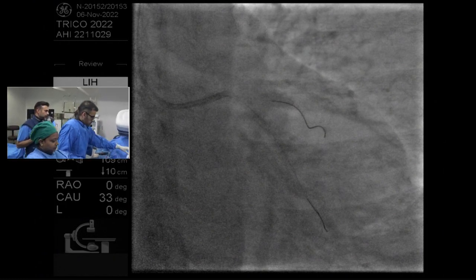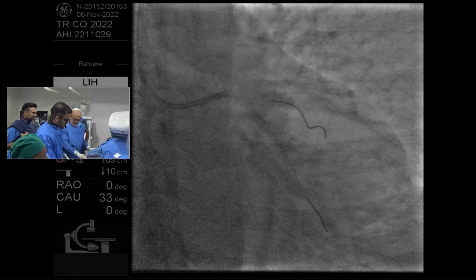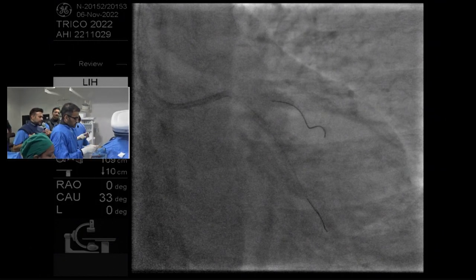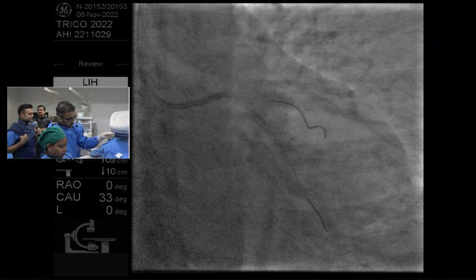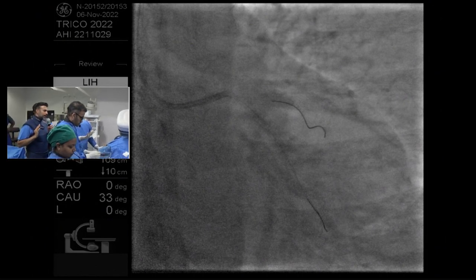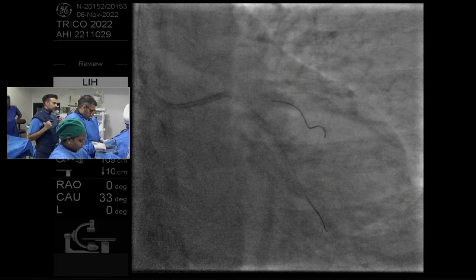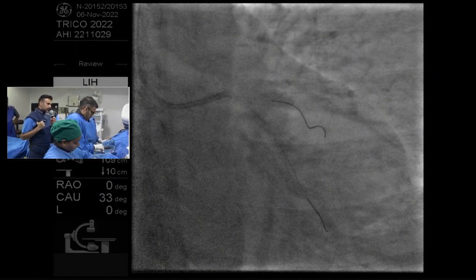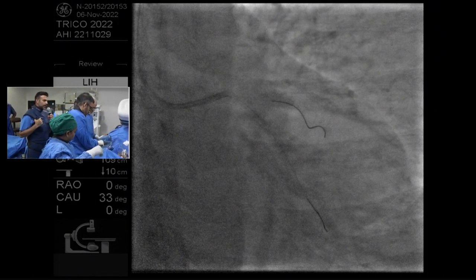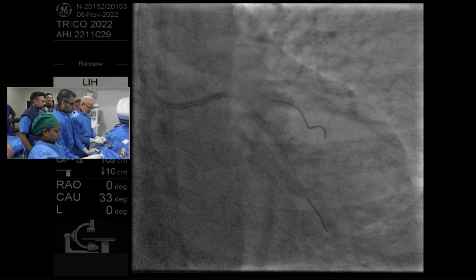Now the question I have for you is, are you going to do the final picture? I think we'll take a final picture. Yeah. So this is for the panel. Because this is a live demonstration course, and I don't want the audience to go away with the idea they have not shown the final result. I would actually go a step further and ask the panel, is there a difference between zero contrast and 3 or 4 cc's at the end? I don't think so. Which is why you may do the procedure with nothing, but I almost always take a final picture because I don't think I'm hurting the patient.